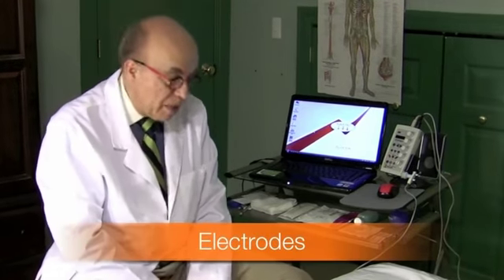Let's talk now a little bit about the needle electrode. This is the needle EMG part of the study. So for most exams, we do nerve conductions and needle exams. Now, some exams you probably will get away by doing nerve conductions alone. For instance, carpal tunnel. If it's not severe, just by demonstrating that there's slowing across the carpal tunnel, you have your answer. Peripheral neuropathy, rather acute onset low back pain, to see if there's changes in H reflex.